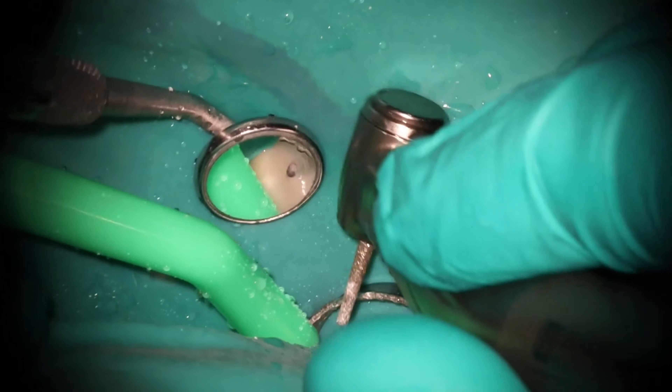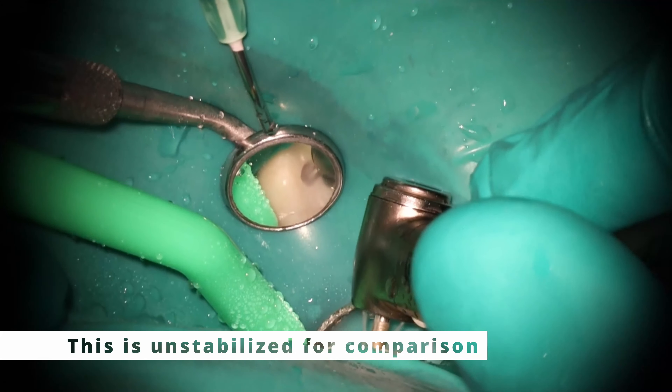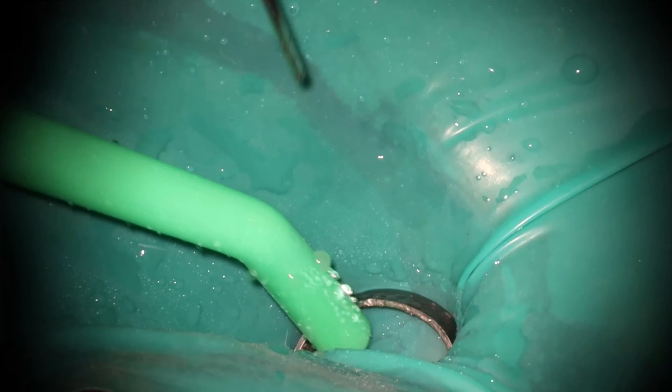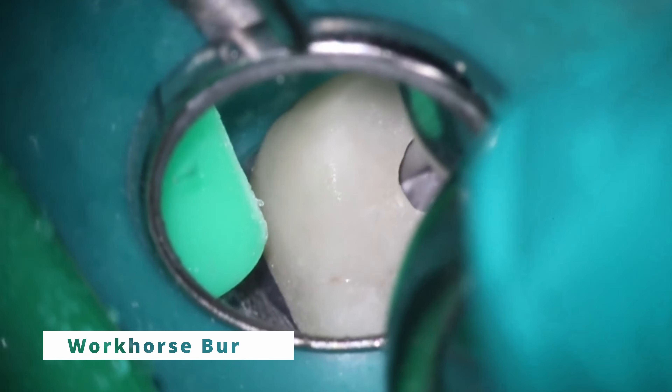So we'll have a little bit of work to get past those, and I'll show you how we do that. Go ahead and drill through that beautiful Emax crown — lithium disilicate — the purple burr really does work well for this. I did keep everything in; you will see a couple of cuts here and there, just to make it easier for DaVinci to stabilize the footage. One thing I've started to do is keep the access as small as possible, but for retreats in particular, they're going to be big. You can see from the bite wing how big the access was to begin with.